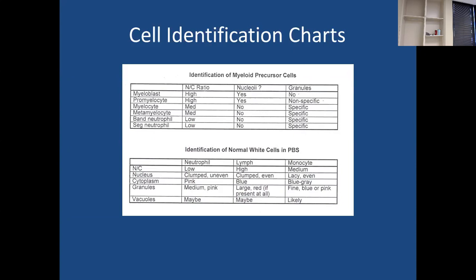The myeloblast has a high nucleus to cytoplasm ratio. Most of that cell is comprised of nucleus, but the nuclear chromatin clumping is very, very fine. It's not going to have any condensation at all, so it won't be dark at all. It's going to be very fine. You can also think about size. As the cell goes from very immature to mature, it's going to decrease in size. Also, the nucleus is going to decrease in size, and it'll even change shape for our myeloid, our neutrophil lineage.